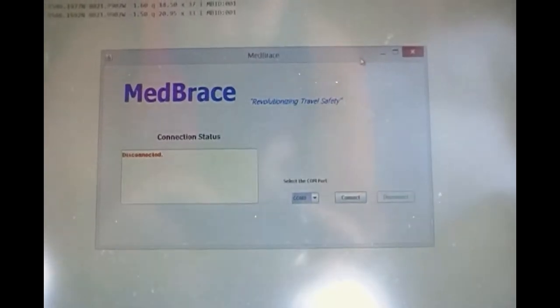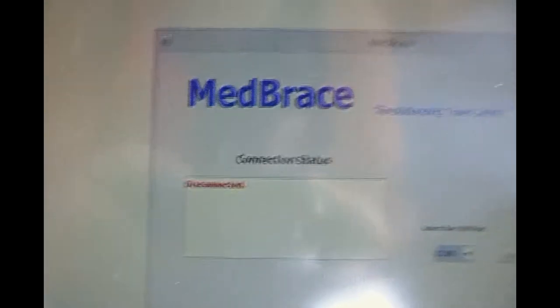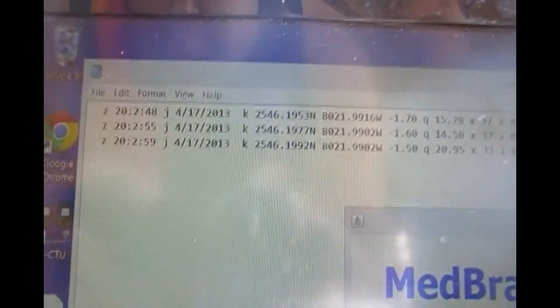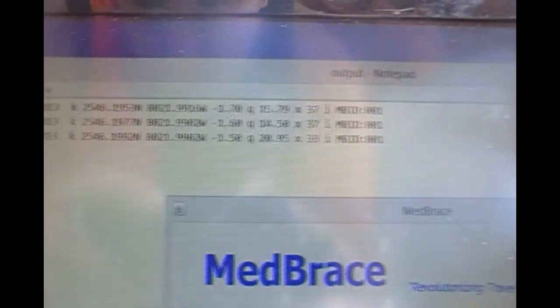Here we have the GUI that we designed for the console. It displays the connection status, and when connected, begins to log all the information received from the MEDRACE system — the time, the date, the coordinates, the temperature, the pulse, and the ID of the bracelet.